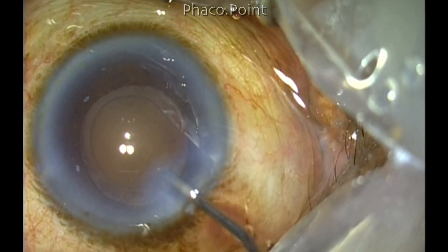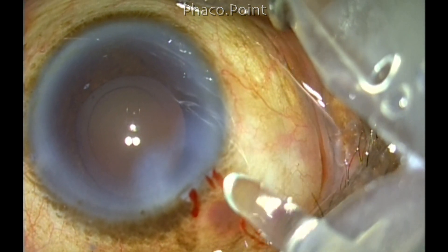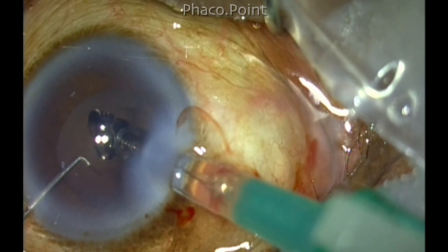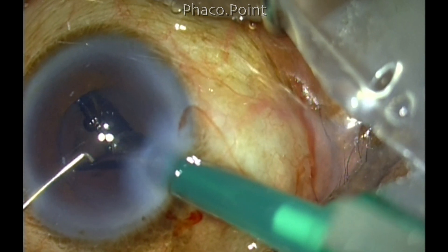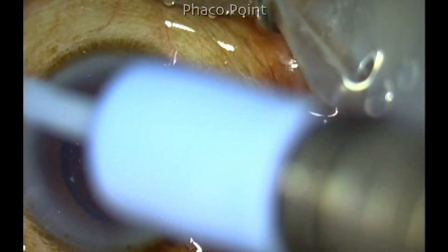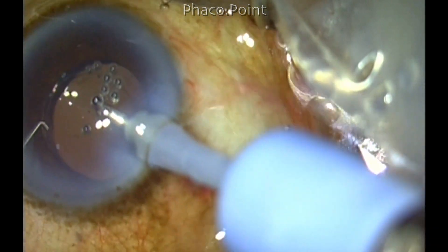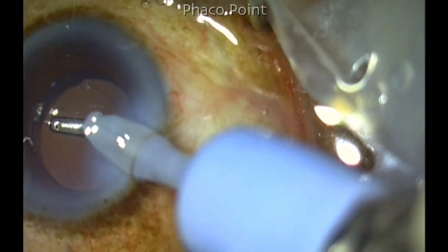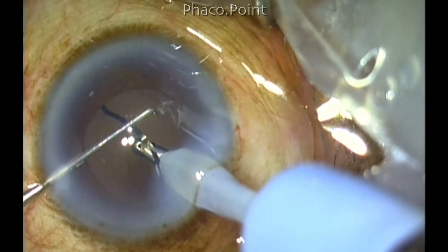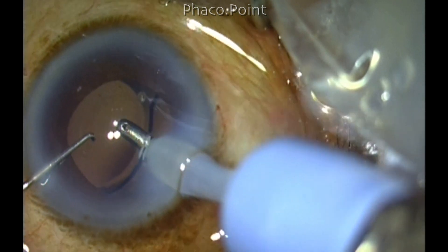Now while inserting the intraocular lens through the sub-5 millimeter capsular rhexis, make sure that you try to get the lens — at least the leading haptic — into the bag, because you don't want too much manipulation by putting it in the sulcus and then putting it in the bag. In this case, the entire lens was delivered directly into the capsular bag. Try to keep the manipulations quite gentle, because if you were to roughly push the optic downwards in a smaller size rhexis, you could create a zonular dialysis. The viscoelastic is washed out from the anterior chamber and from behind the intraocular lens. Keep the bag empty so you don't get a capsular block syndrome postoperatively, which has a higher incidence when you have a smaller size capsular rhexis. Make sure you remove all the viscoelastic.